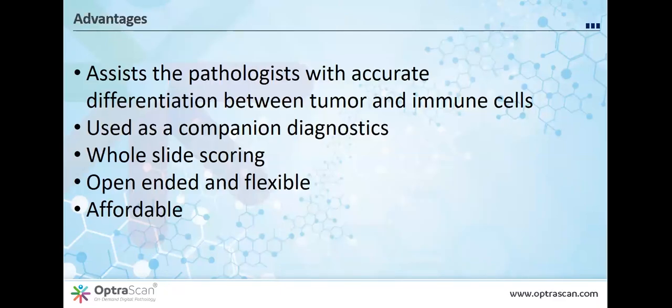I'd like to state here that no matter how hard the naked eye tries to improve, some challenges can only be overcome by the aid of a machine. And again, this is companion diagnostics. We've developed this tool to aid pathologists to make their lives easier and help them alleviate some of the major challenges today. The beauty of the tool is that it's always learning, and it presents a beautiful interface for the pathologist to report an accurate score.